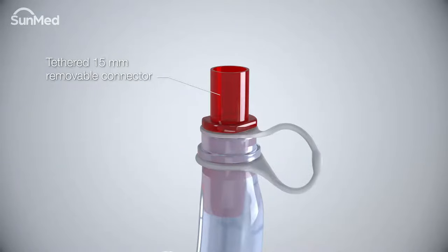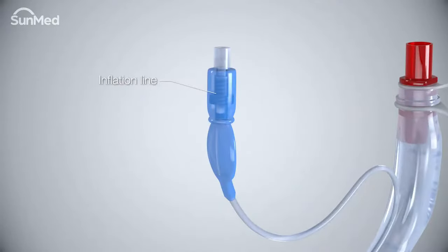The tethered removable connector is color-coded for easy size identification and allows intubation through the air Q3 tube. The inflation line is used to manage the inflation and deflation of the cuff.